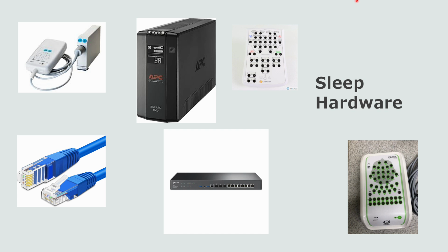that stuff annoyingly loud. Some head boxes have the amplifier built in, like the Compumedics Grael head box, but this makes the head box incredibly fragile and susceptible to damage. They are also incredibly expensive to repair.